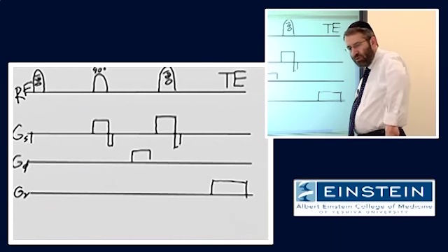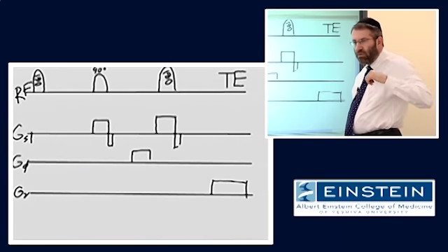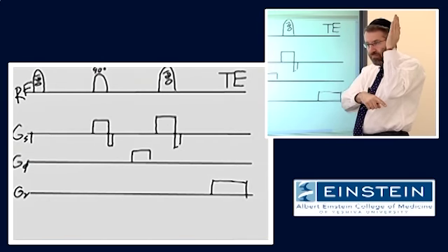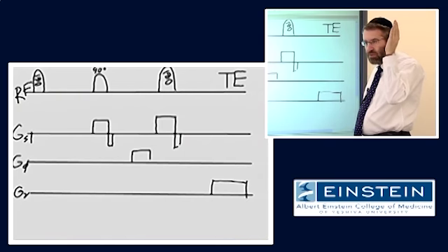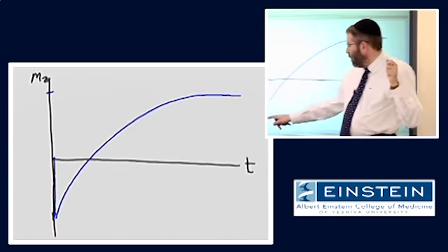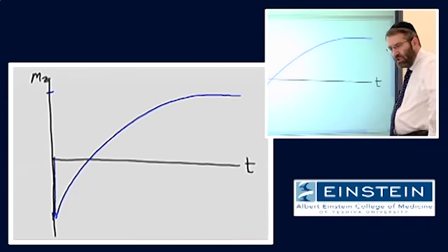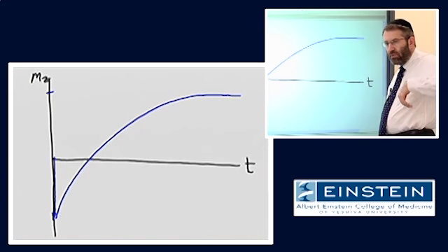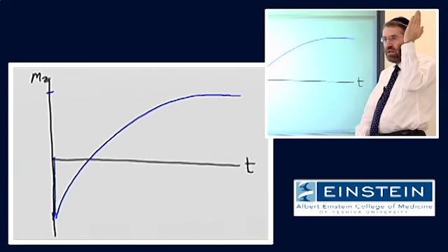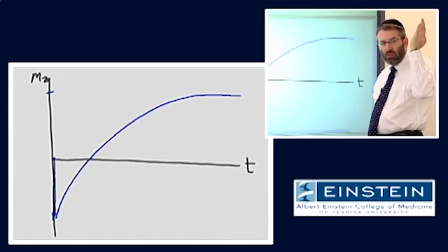So the trajectory of this relaxation is that it shrinks to 0 and then regrows. The whole time with no net transverse magnetization. So what this curve represents is that inversion and then regrowth through 0 of the longitudinal magnetization, never having any net transverse magnetization throughout that entire period. Okay?